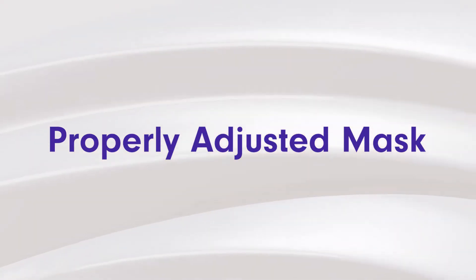A properly fitted mask is one of the biggest keys to making sure that your CPAP doesn't make any noise. You want to make sure that mask fits properly so there's a perfect seal. The second tip actually has something to do with the first tip, which is a properly adjusted mask. The main cause for CPAPs making noise is actually an ill-fitting mask that is improperly adjusted.